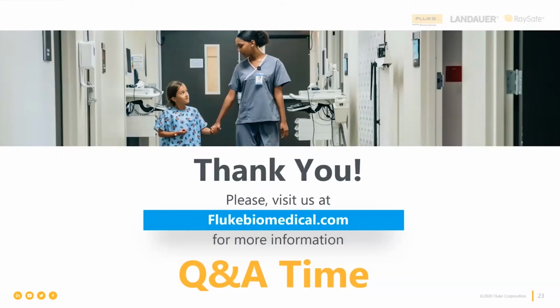And the AED is going to analyze the rhythm, and it should say to the person using that AED, no shock advised, or no, we can't shock that one. You're going to hear that not only does it tell you shouldn't shock that rhythm, but it won't let you shock that rhythm. And then I want to give it a shockable rhythm, usually just VFib is fine. VFib will then cause the AED to properly analyze and identify that this rhythm is shockable, and it should allow the shock to happen.